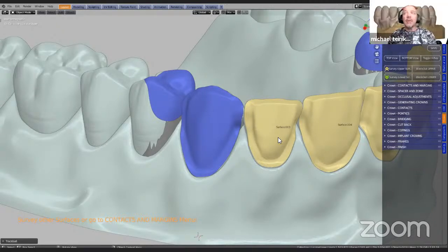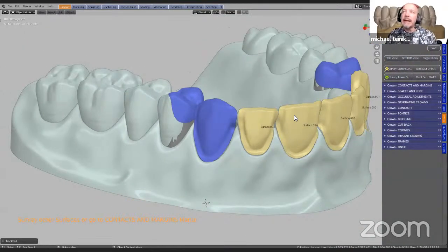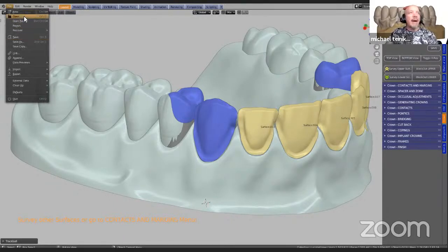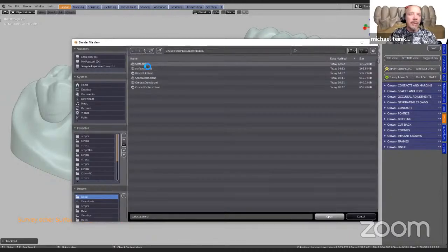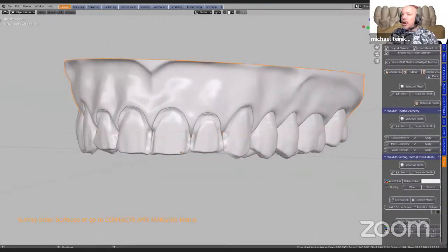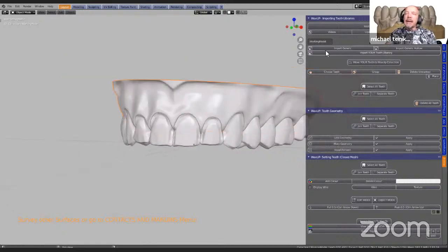One thing I did forget to do is bring in our tooth library. We should have done that right from the beginning, but it's not too late — we can do that later on as well. But just to show how this works, I'm going to go one file back and then continue. So we're going to go into our wax-up module. In our wax-up module we have a generic tooth library, so I'm going to bring in a few teeth just to demonstrate how this works.